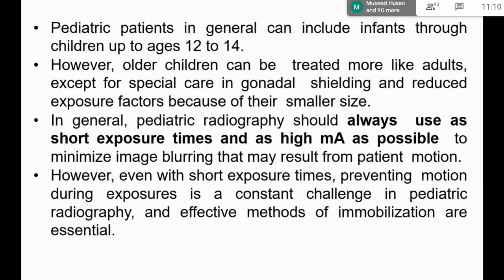In general, pediatric radiography should always use a short exposure time and a high mA technique so that the radiation dose can be minimized, following the ALARA principle, and image blurring can be reduced. With a short exposure time, patient motion artifact can be minimized. However, even with a short exposure time, motion artifact during the exposure is a constant challenge in pediatric radiography, so effective methods of immobilization and restraint are needed.